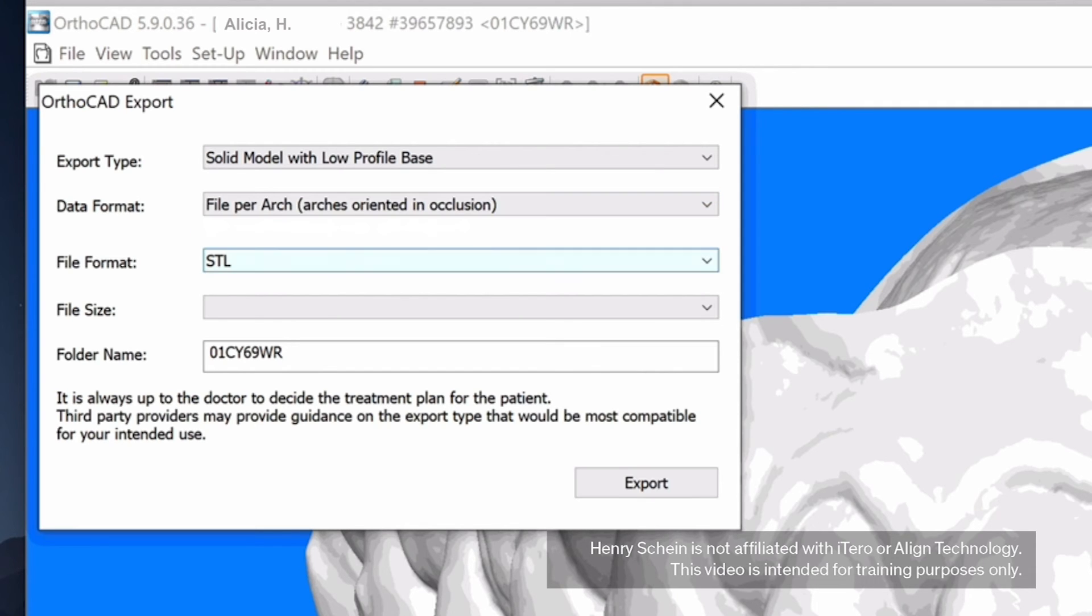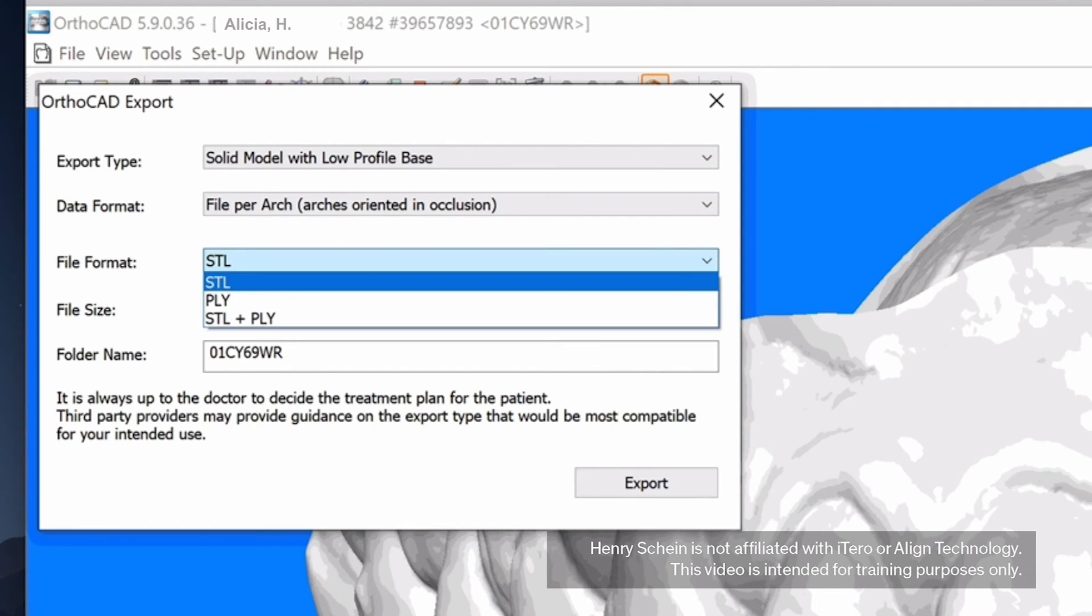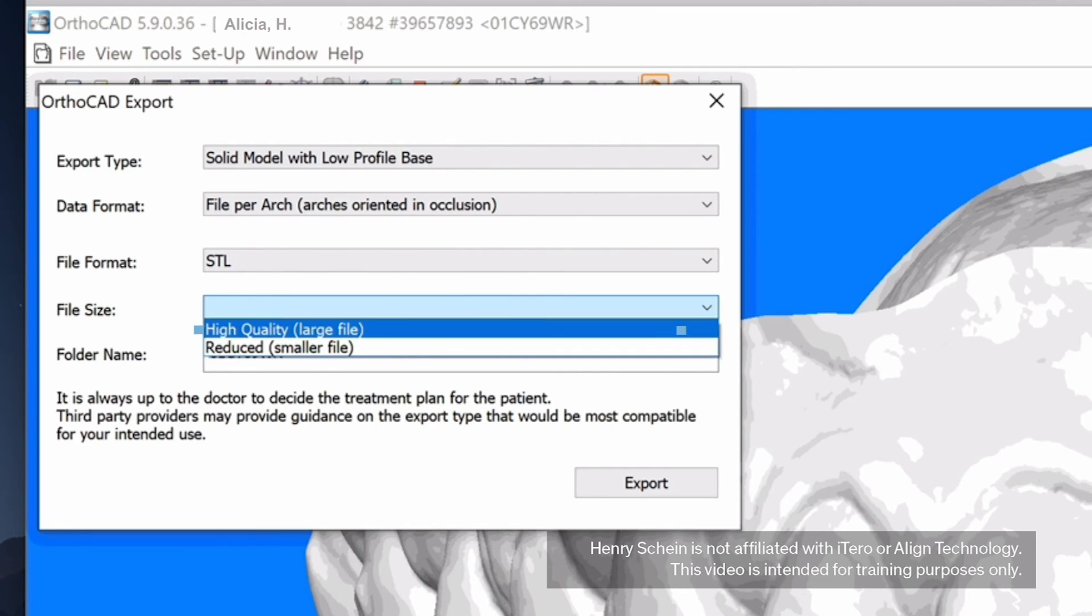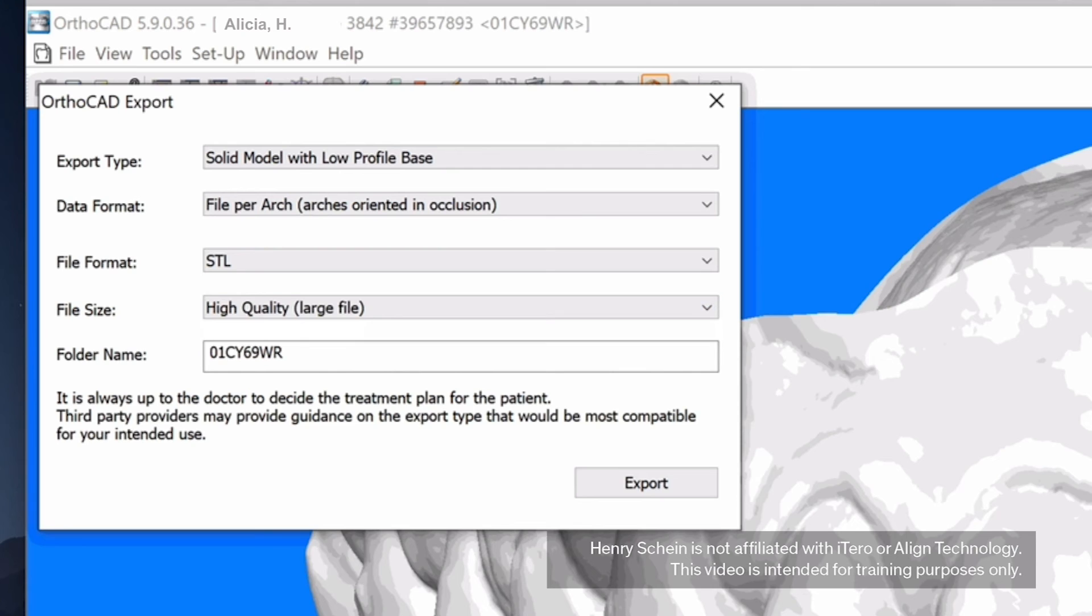File Type: Choose STL. File Size: Select High Quality Large File. An export folder name will be generated automatically.